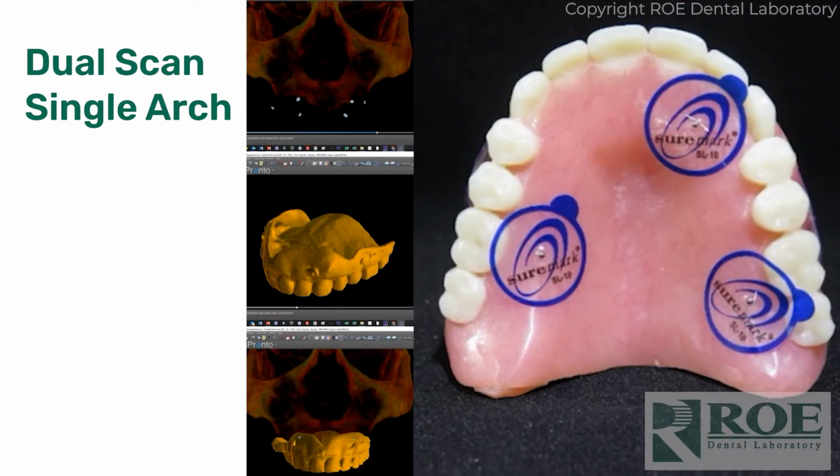And then you'll notice here, let me just change the title of this. Dual scan single arch. The two scans that you're going to take are the denture by itself and the denture in the mouth. This scan is of the denture just sitting on a piece of foam in the scanner. Make sure you can see the entire denture, and it doesn't get cut off. Maybe your scanner has a preview, or after you take the scan, make sure that it doesn't have the teeth or any of it cut off. And then the other scan is of the patient wearing the denture, fully seated, teeth together. So those are the two scans.